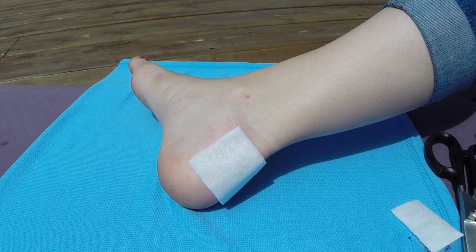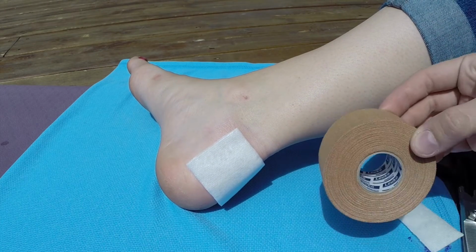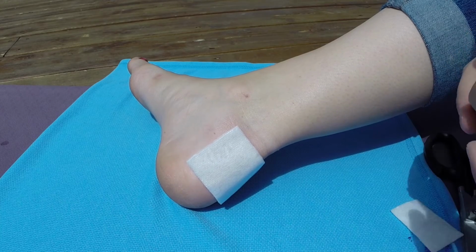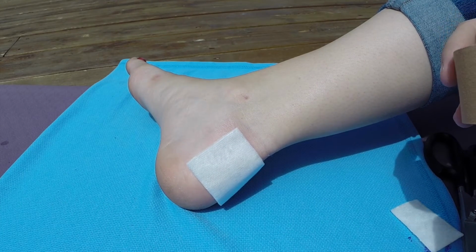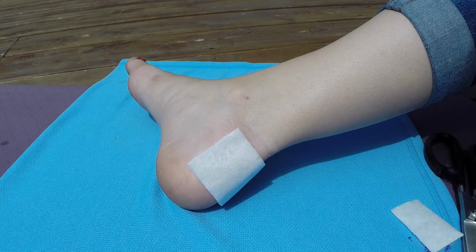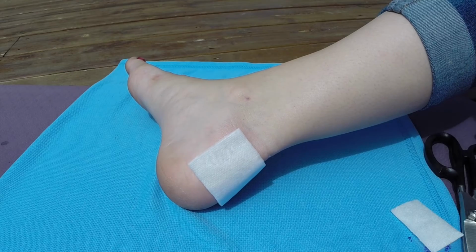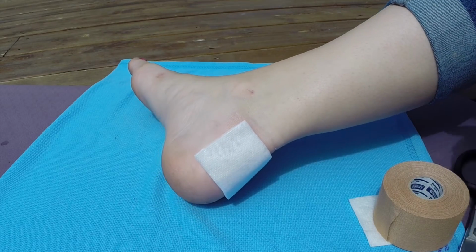Alright, so the final step is to secure this dressing in place. To do that, I'm going to use Leukotape, and you can tape it any way you would, just like you would perhaps tape an ankle normally to stabilize it. So the first thing I'm actually going to do is put a piece of tape underneath my ankle to act as a bit of an anchor point. That's just going to go underneath the arch of my foot.